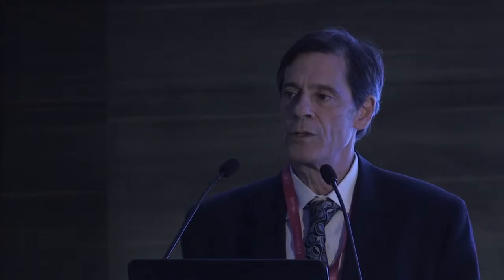And so we undertook a project to automate the measurement of the ellipsoid zone loss to be able to then register the OCT with the microperimetry so that you could overlay the loss area on the OCT with the microperimetry defect to correlate the structure and function changes. And then the next phase was to enhance this process with a deep learning approach to see if we could use this in the clinic and in clinical trials.